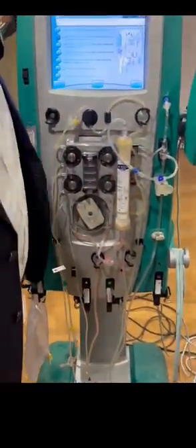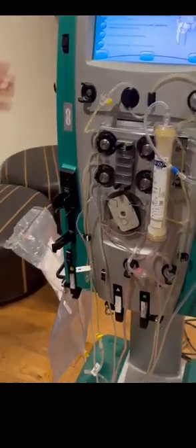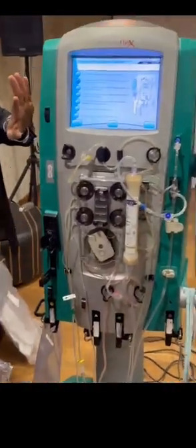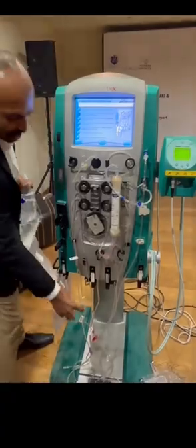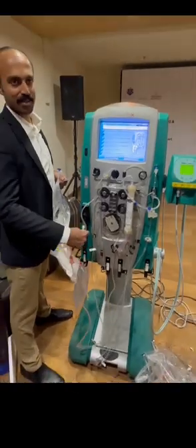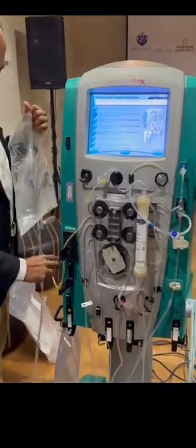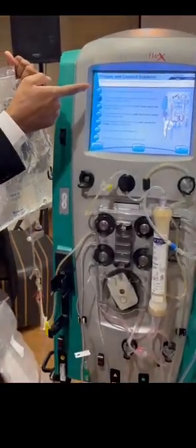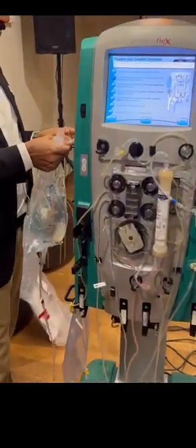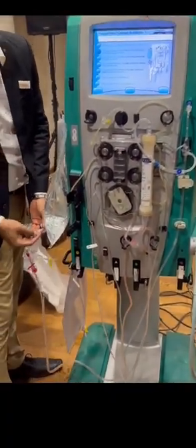One more bag is there. Yes. Here. So for the priming, we need 1 liter of saline. With exactly 1 liter, the priming will be completed. But now I am using this one. Do not use this because it's costly. We can use our normal saline, 1 liter. This line I already hung here at the time of this connection, this access line along with the effluent. Connected with saline, so we have a spike to spike it if it is saline. That I removed from here.